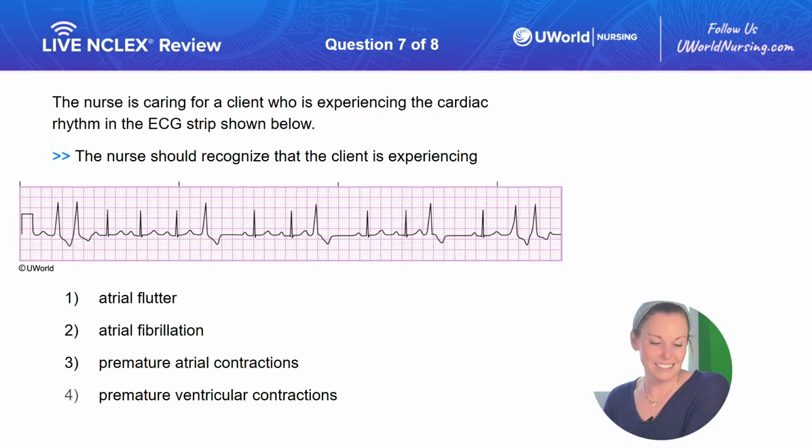But congratulations. But again, if you guys are just joining, we're covering ECG questions. So all of those tricky ECG strips, we're walking through, hopefully breaking them down a little bit for you guys, but we'll have this available on demand when we're done, so you can go back and practice if you're just now hopping on. You can slow it down, look at everything, take your time answering these questions. We also have a Live and Learn lecture on ECGs as well, so you can always search that. It's helpful to search them typically on YouTube, so feel free to check that out as well.